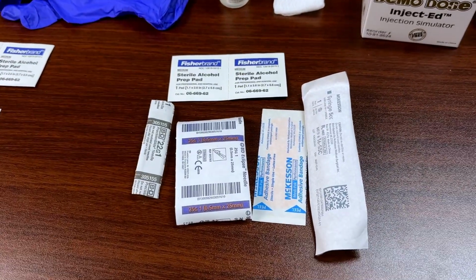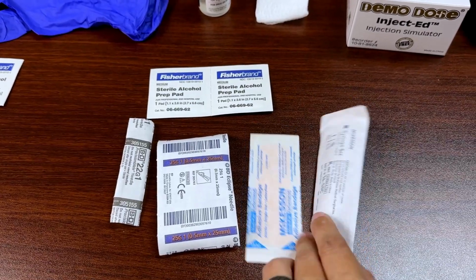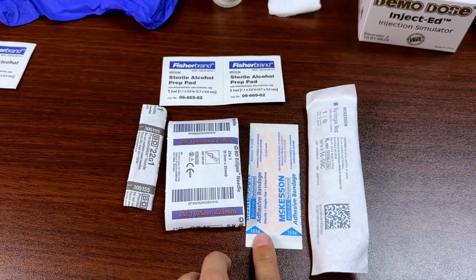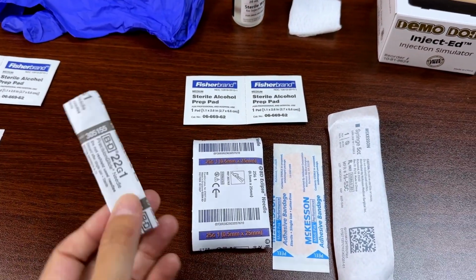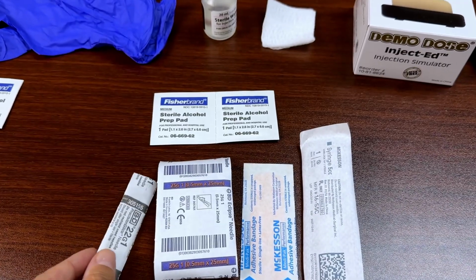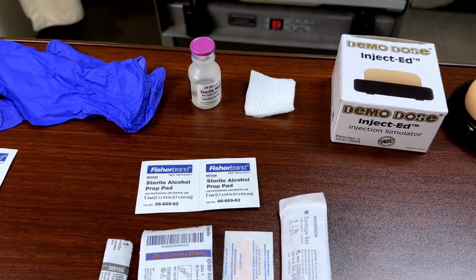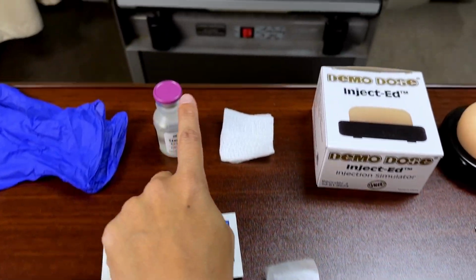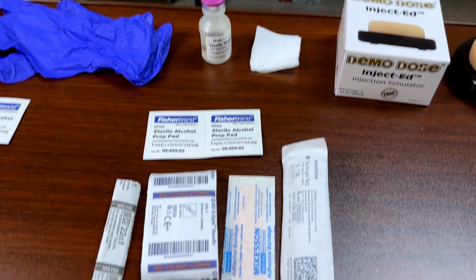In the middle here we have the intramuscular injection equipment. So we have a 5 cc syringe. You can use 3 or 5 cc syringes for this. We have a Band-Aid, and then we have our drawing needle, which for our sake, we're going to be using a 22 to do for drawing. It's a little bigger than what we'll use for injecting. But we don't want to use the typical drawing needles, which are blunt, because they'll make a big hole in our equipment and we won't be able to reuse them as often.